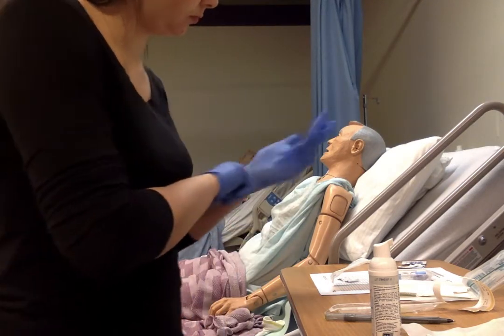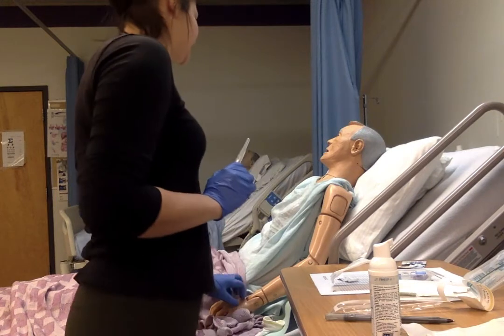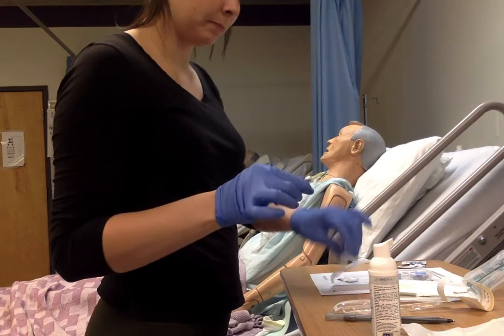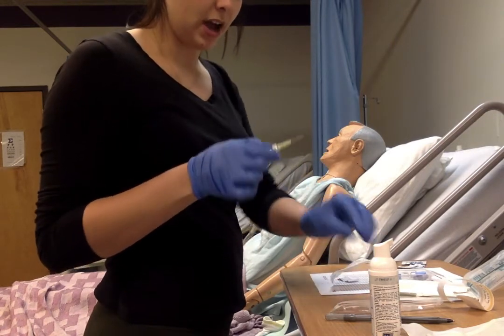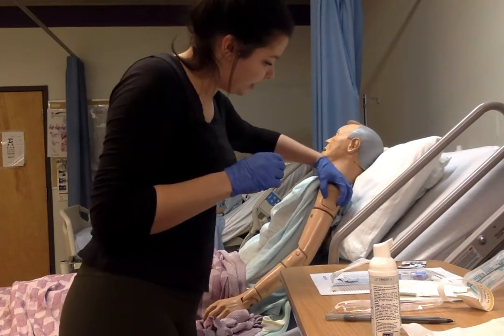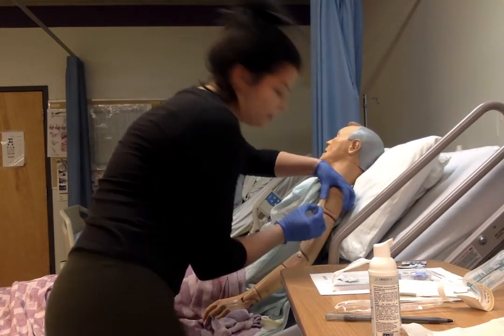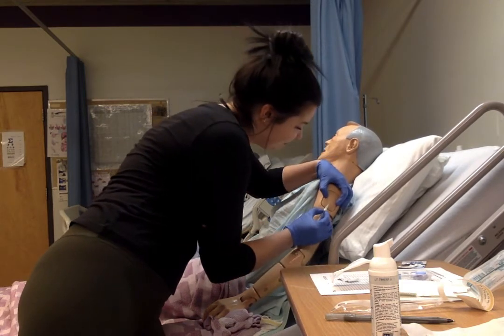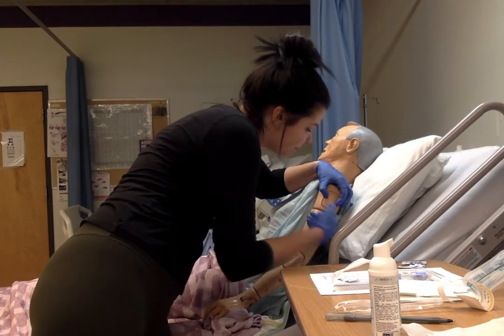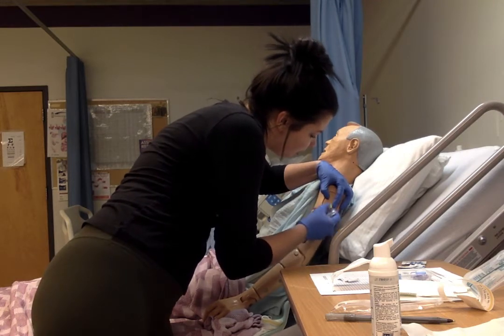All right, Rupinder, I'm gonna poke you with a needle. The needle won't stay in you, but a little plastic tip will, and that's how we're going to administer your drug. So you're just going to feel a little bit of a poke here. And I want to make sure that I have my bevel up. So, all right, I'm going to go in here and I'm going to pinch an inch and I'm going to go in at a 30-degree angle. All right, so imagine I'm pinching. There's no pinch here. All right, little bit of a poke here. And we're just going to go in all the way. Flash. And that's good.